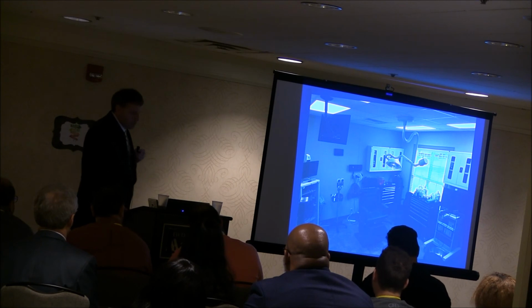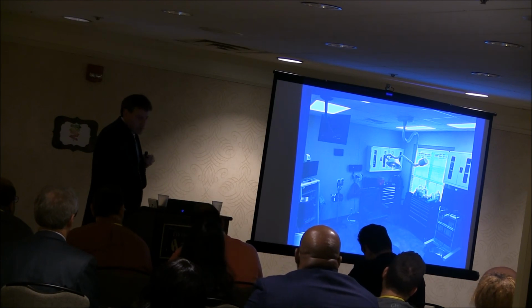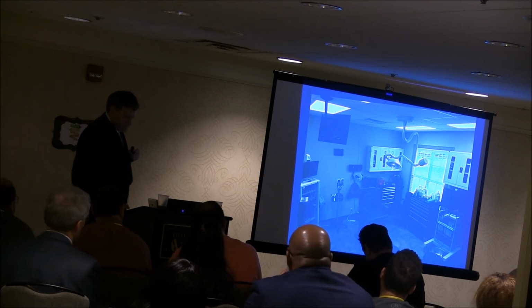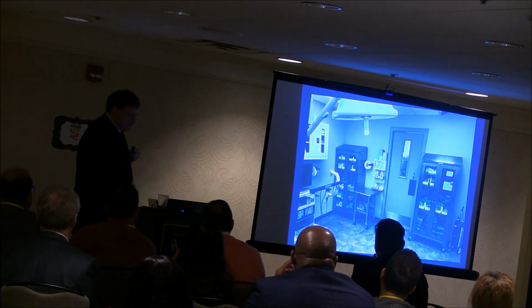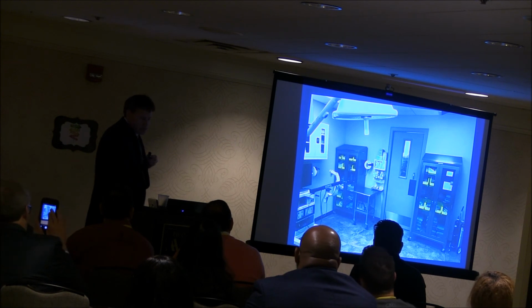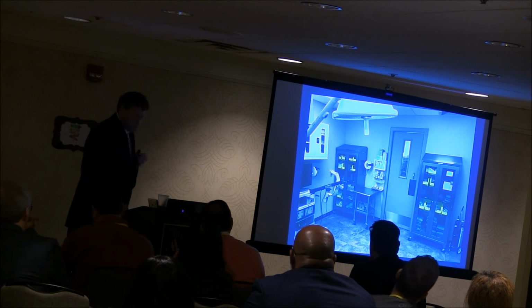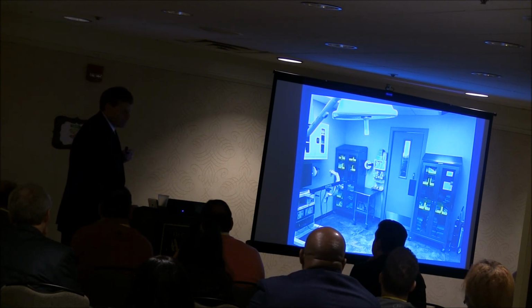If you look at this room, you've got your ankle scope, you got your lights, you got a TV set, a barrier, a person can watch TV while the surgery is being performed. We've got a little tourniquet there. We've got our nitrous oxide gas. We've got our little C-arm, little Stryker TPS unit with our OSADA drills as well. And then this is the back side. We have our little clean room in the back, and we have sterile drapes, oxygen, C-arm, all that kind of jazz in there. But that's what I've just decided to do, and to be honest with you, I won't go back. I just will not go back.